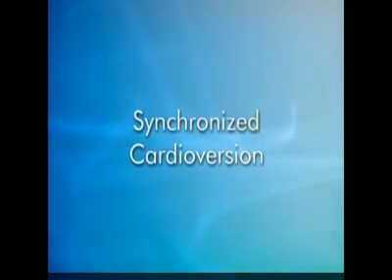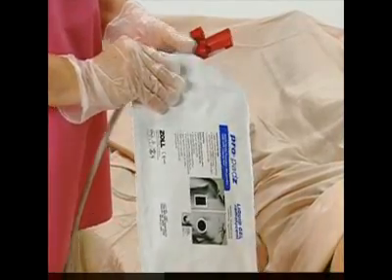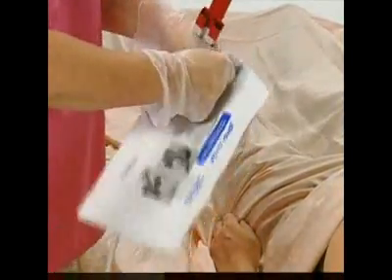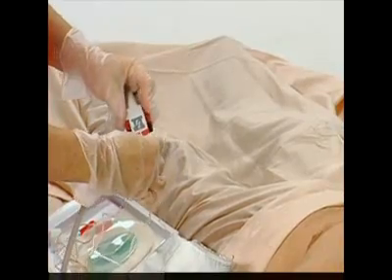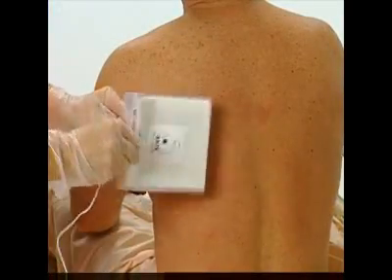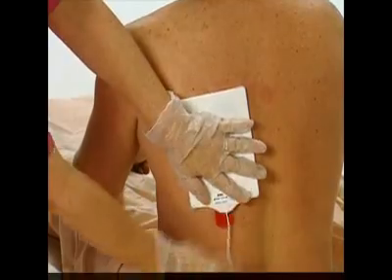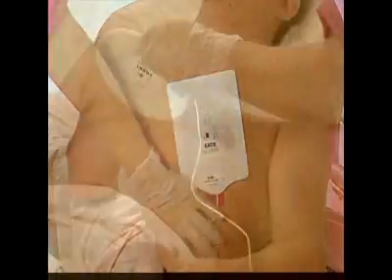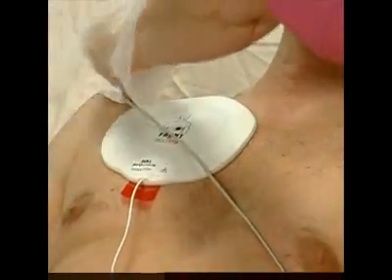Synchronized Cardioversion. For elective cardioversion procedures, Zoll recommends you use wet gel specialty procedure electrodes called ProPads for maximum efficacy and the least skin effect. Roll the back pad onto the patient to the left of the spine and under the scapula. Place the front pad on the patient's right chest so the edge of the pad is aligned with the sternum and the top of the pad is under the clavicle.